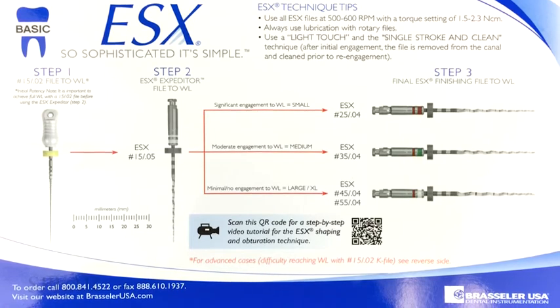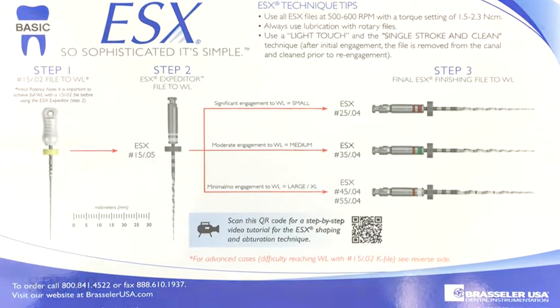If you feel that it's a size 35 or a 25, you take a 25 and you see there's a lot of tissue left in there, and there's a lot of tissue in your flutes, because you always should examine the flute of a file as it comes out of the canal to see what's in it. If you still see a lot of live tissue, there's still a lot of bleeding going on, you're still inside the canal, but there's a lot of tissue tags that are causing the bleeding, I'm not telling you that you're locked into a 2-file system. You can then move on to a size 35.